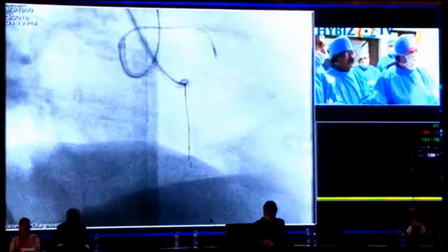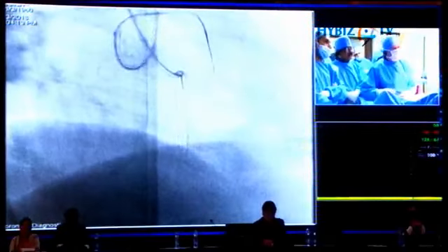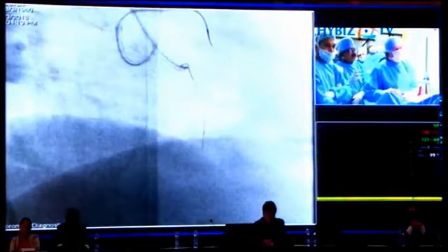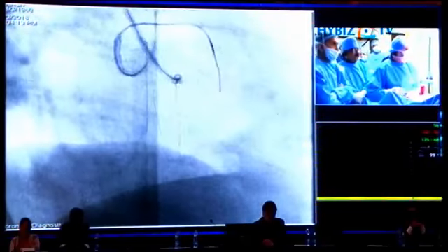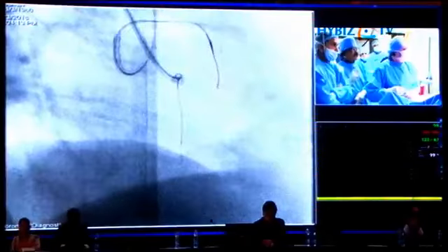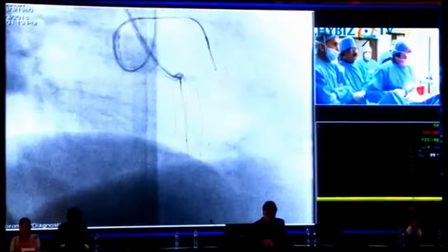So you are now with a regular Sion. Yeah, this is a regular wire. The regular Sion is that hydrophilic wire, so the traversing is easier with it, but sometimes the hydrophilicity also gets you into the problem of perforations. So one has to be knowing that and be careful about it. It's difficult to get the first bend already.